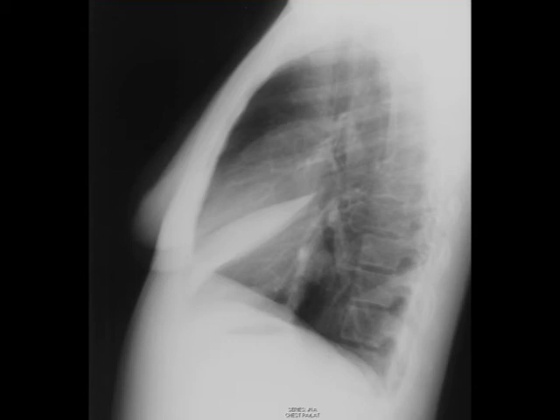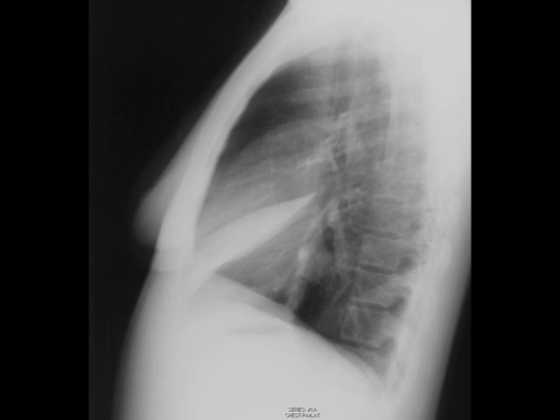Right middle lobe atelectasis can be caused by mucus plugging or something like that, but it can also be a more serious endobronchial lesion such as a cancer or a foreign body. Sometimes the right middle lobe bronchus can be compressed from something outside the bronchi. I just want to show you this case so you can see how subtle that can be on the frontal X-ray.